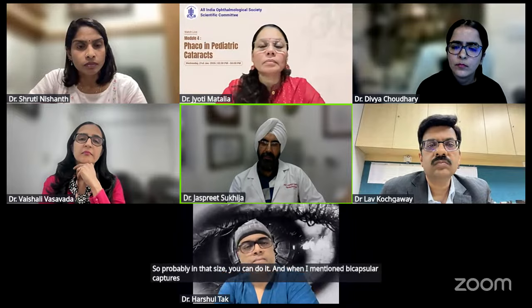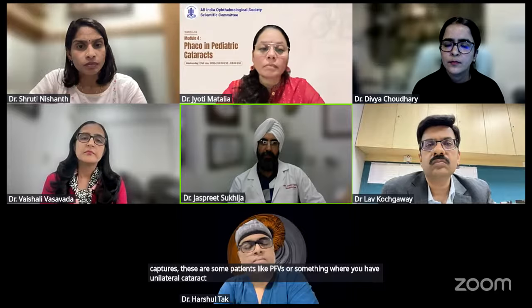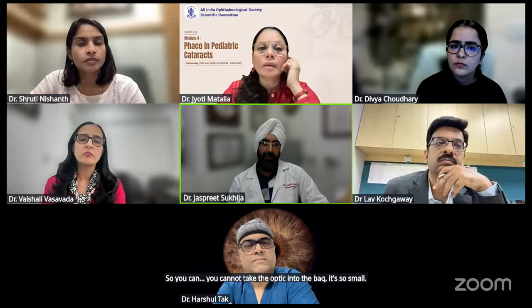And when I mentioned bicapsular capture, these are patients like PFVs where you have unilateral cataracts. You want to put an IOL because obviously leaving them with aphakic correction would lead to amblyopia. In these, the bag size is sometimes smaller, and these are the patients where I do a bicapsular capture. You cannot take the optic into the bag, it's so small. So it's just the optic which goes in and the haptics are outside. The 6 millimeters can go inside, but the 12 millimeters won't go inside the bag.